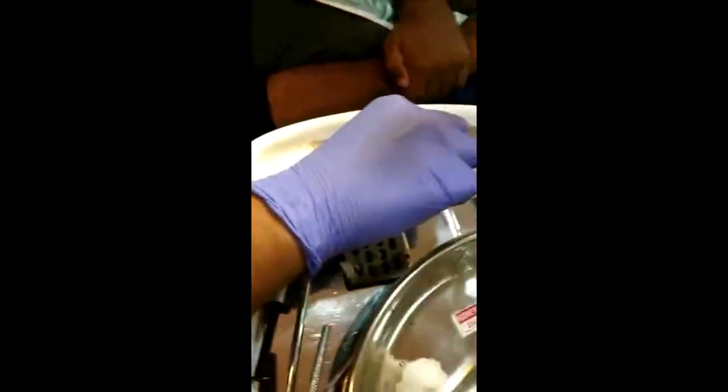Now we can see that the brackets already are coated with some amount of composite adhesive material, and over that we are placing a very thin layer of flowable composite material in order to bond the brackets to the tooth surface. Now, after applying a very thin layer of flowable composite, we are just going to dab the area with a bonding agent using an applicator tip, just to confine the area of the adhesive material and also to evenly spread it.